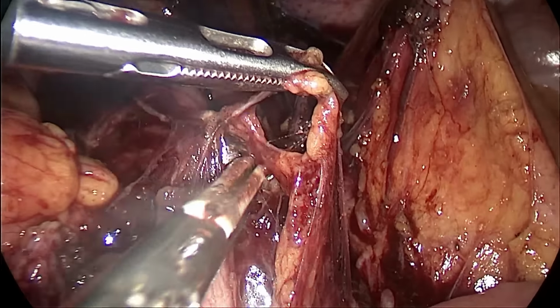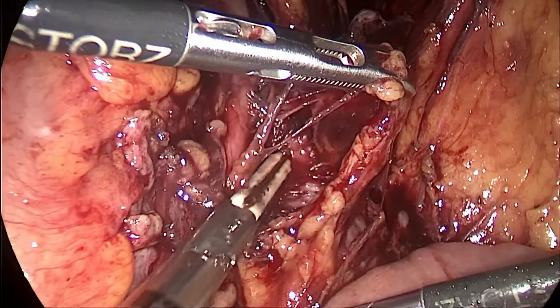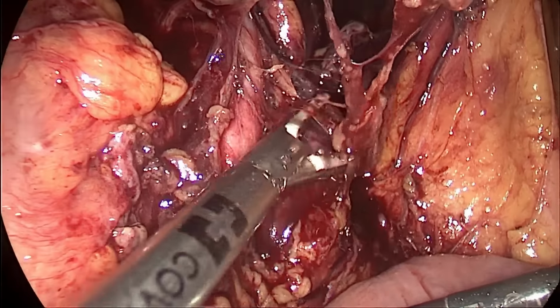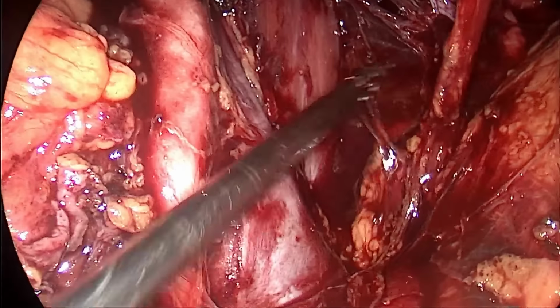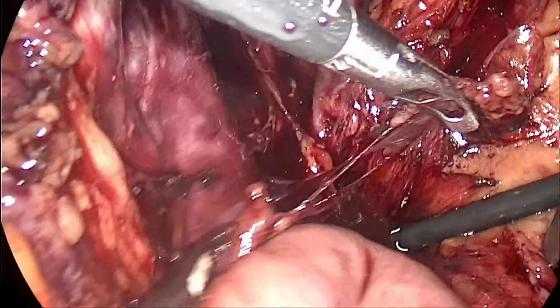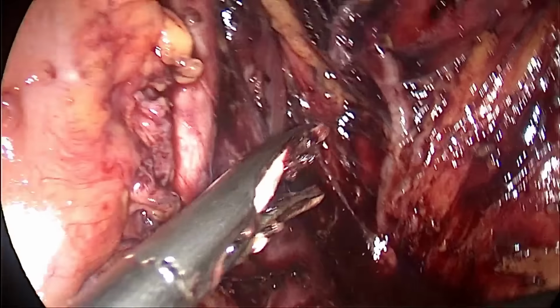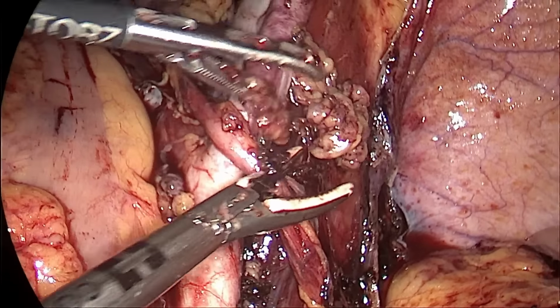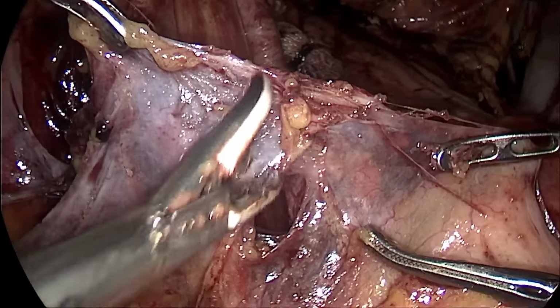So we are moving upwards towards the common iliac junction. So that's the vein, and then the psoas major is very much prominent. So that part of the paracaval lymph node is also removed. We're keeping it on the psoas for the time being.